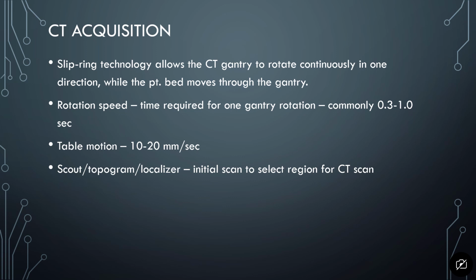And so with that, the X-ray tube remains stationary and does either an anterior, posterior, or lateral view. The table will move through the gantry while the X-ray exposes continuously, but the X-ray won't rotate. So you just get an anterior or posterior view of their anatomy, or you get just a lateral view, depending on which one you took.